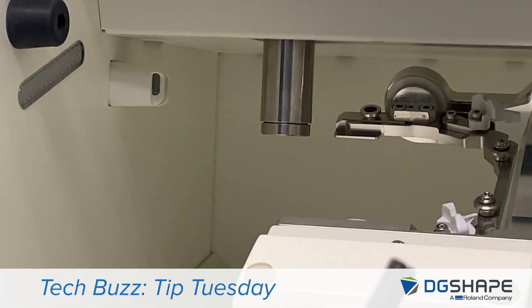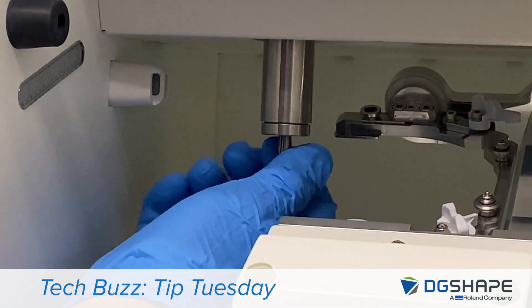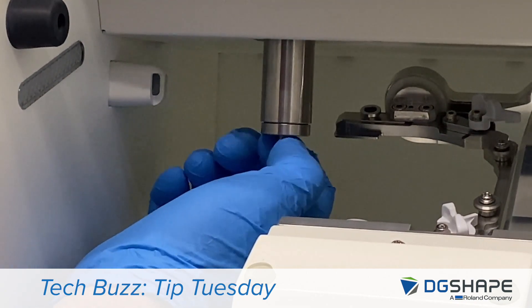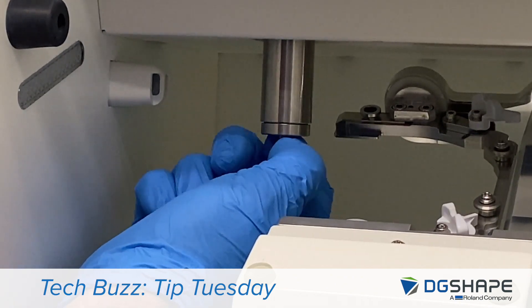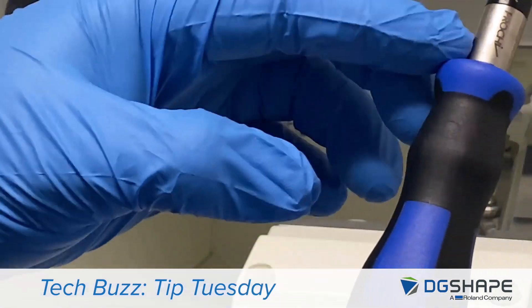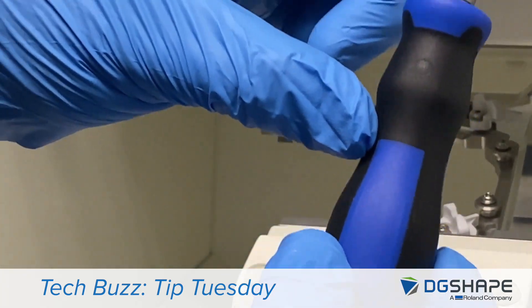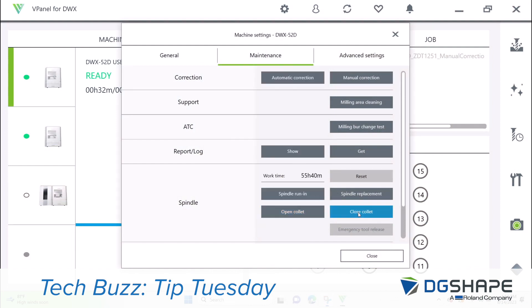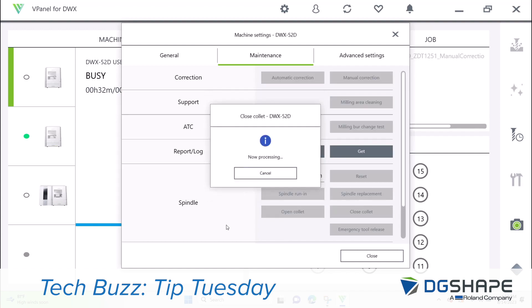Once everything's clean, we're going to go ahead and reinstall the collet. Thread it in and make sure you feel that it's threading smoothly, then take it until it stops. Come in with your collet tightening tool. With the new style spindle, they include a torque wrench, so this will tighten the collet to the exact torque it's supposed to be tightened to. Then we're going to go back to the panel and hit OK, tell it to go to the closed collet position, and hit OK.